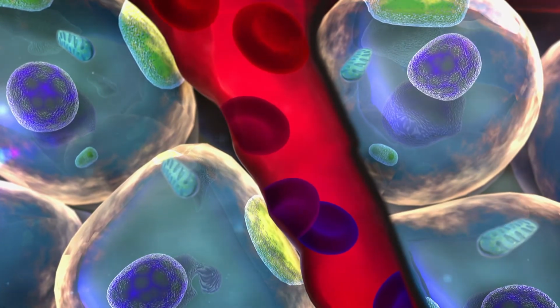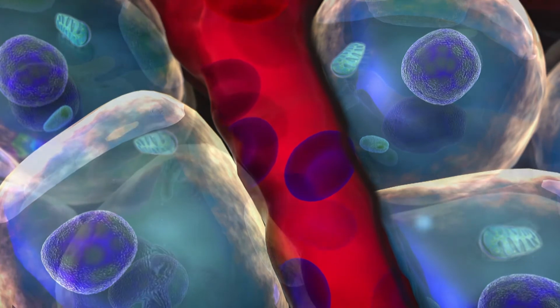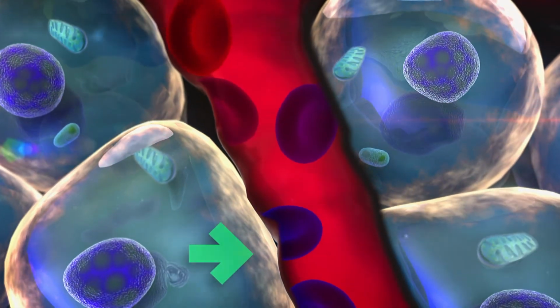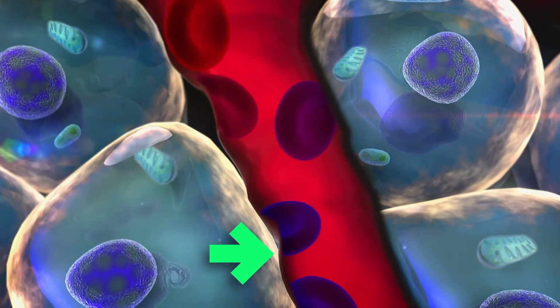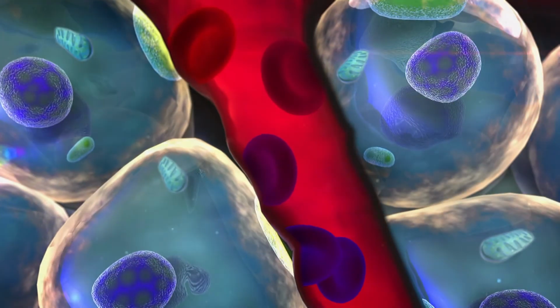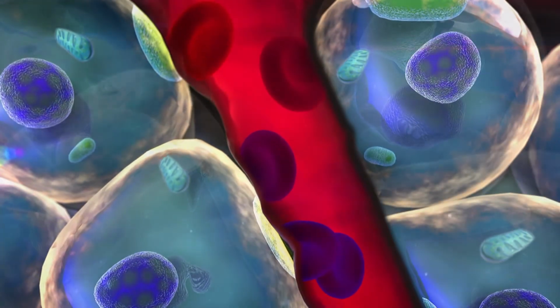When patients are sick, oxygen delivery can be compromised, and identifying when that occurs is vital to proper treatment. Until now, we have had to analyze blood that passes through a tissue to assess its health. Unfortunately, markers that we gather in this way tell us nothing about a specific organ we might be interested in. For example, here we are interested in figuring out how well the heart muscle is metabolizing oxygen after heart surgery.